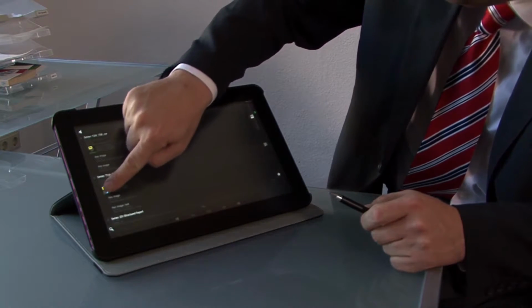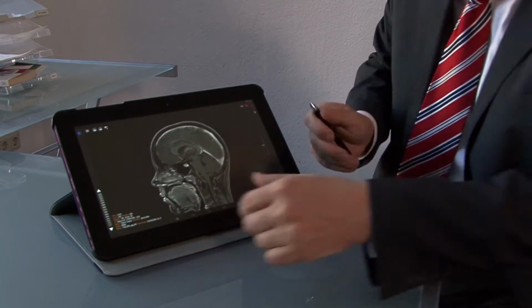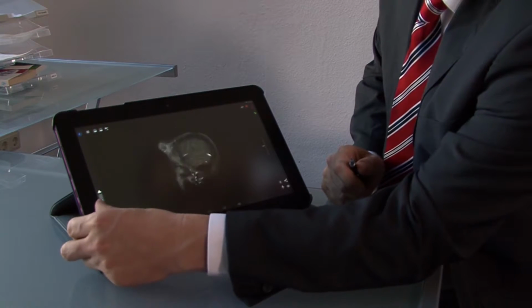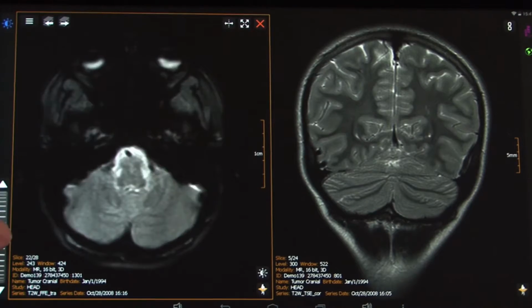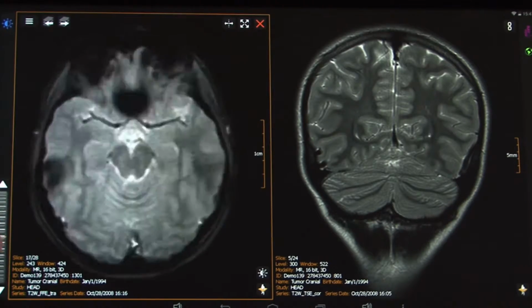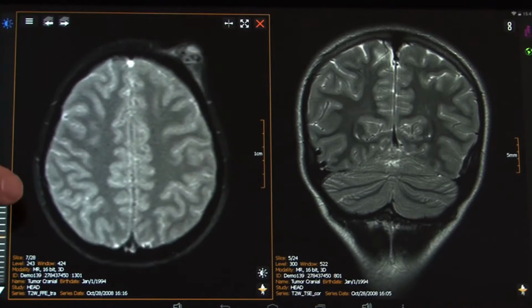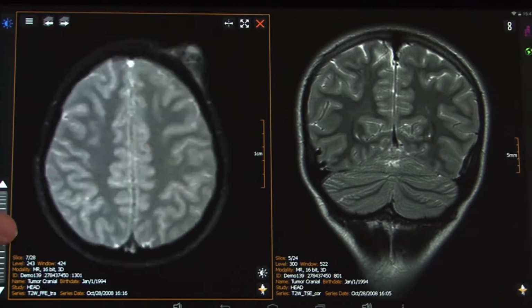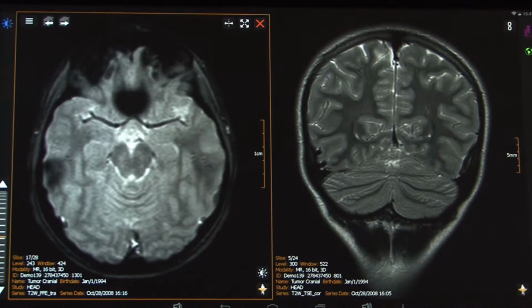So pixels should have a minimum size in order to have a good angle for our human eye to see it. The grayscale calibration should deviate maximum 10% to the proper linear curve. So our MedTab reaches plus minus 5%, while consumer displays usually exceed that curve by more than 50%.